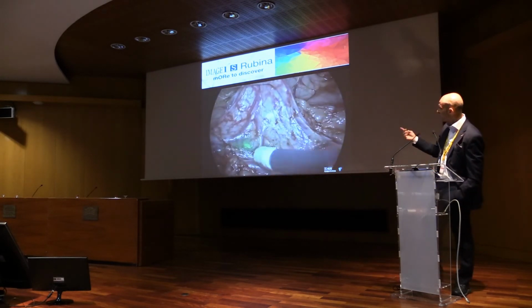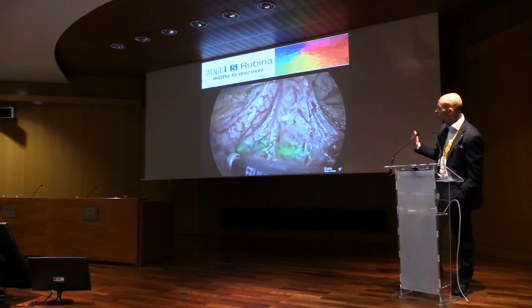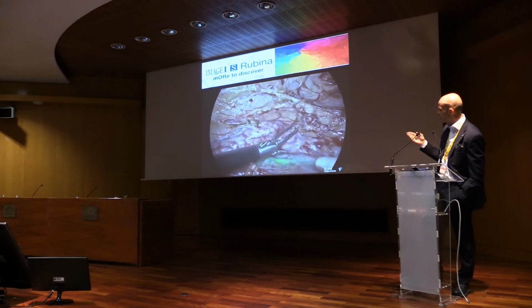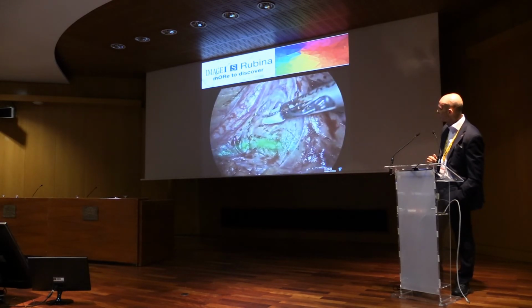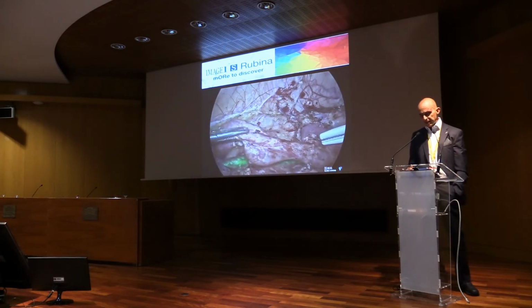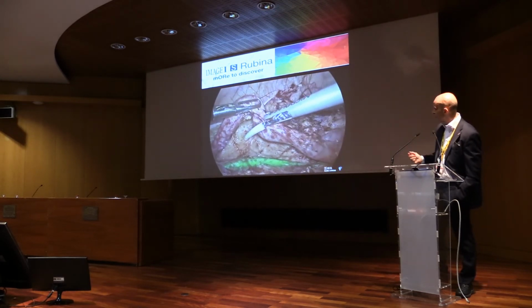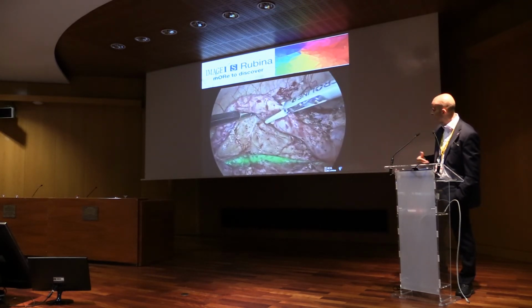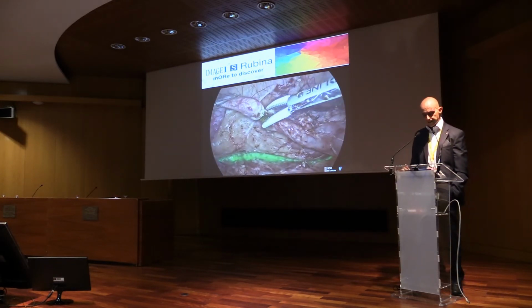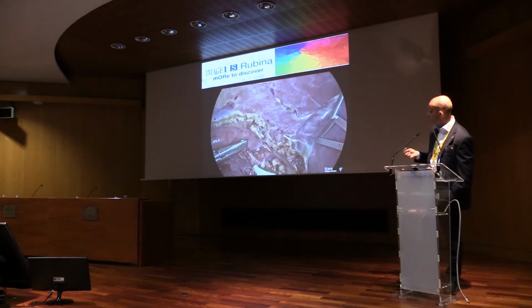You can see the ureteral part, as you can see the normal ureter in green and the huge ureter on the upper part. The two ureters are attached, but thanks to green, the normal ureter remains on the bottom of your screen, and you can isolate the other without having risk. Next. And then this is the isolation. The normal ureter is safe, the bigger ureter is isolated. You can clip, in this case we use a sealing device to seal it and then to move to the kidney.